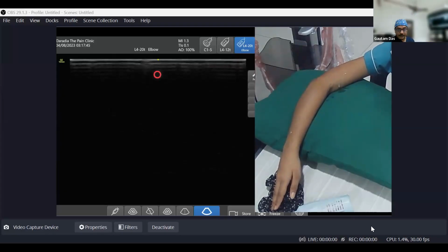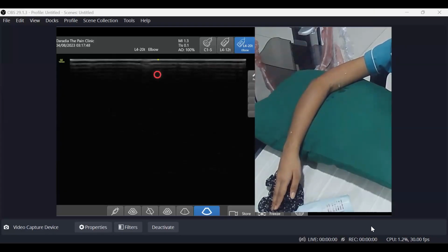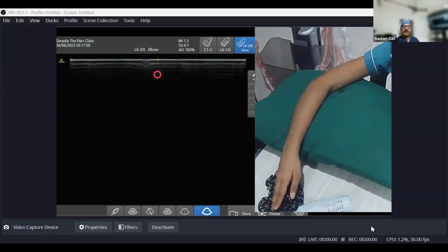Is it okay? Yes, sir. Thank you. Okay. If anybody wish to see any structure again, I can show it again.